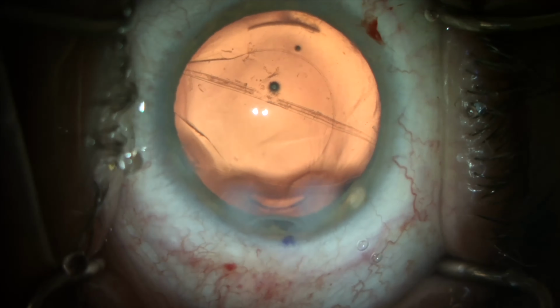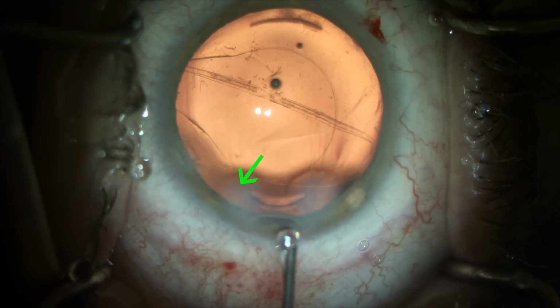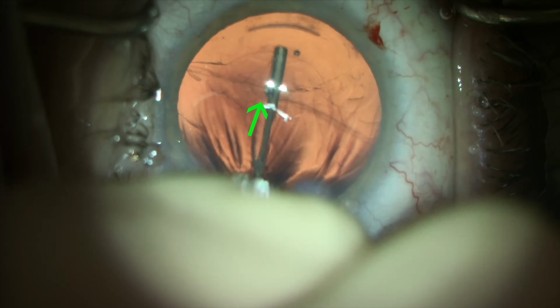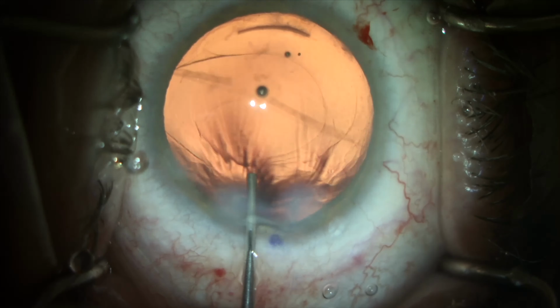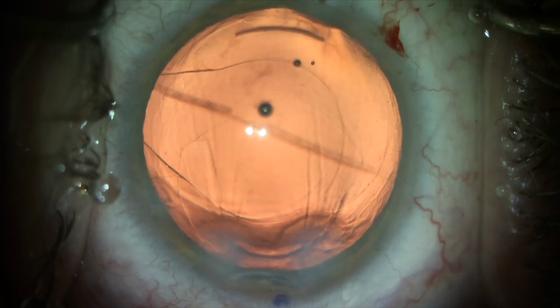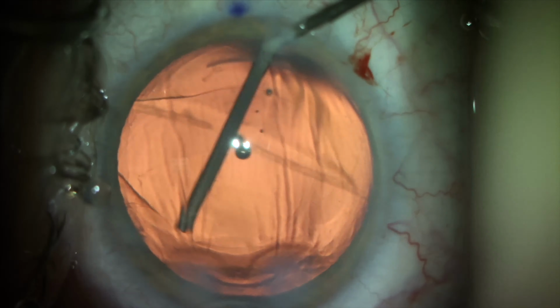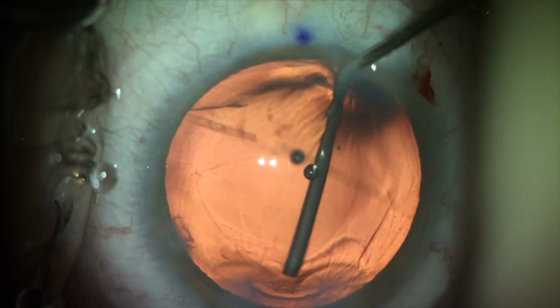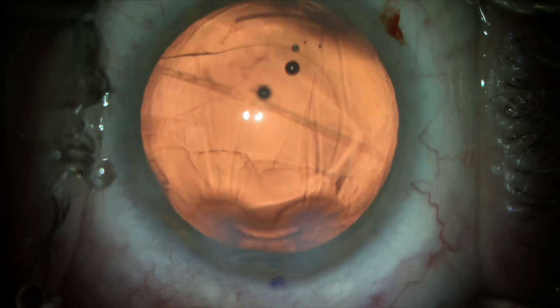We complete the vitrectomy and then consider if we can place the Symphony lens into the capsular bag. It looks like we have some capsular support from 6 o'clock to 9 o'clock and from 10 o'clock to 3 o'clock that would potentially serve as an adequate platform for placement of the haptics of the implant. So we infuse viscoelastic to expand the capsular bag leaflets to obtain a better understanding of how much posterior capsular support we might have to hold a one-piece acrylic lens in the bag.